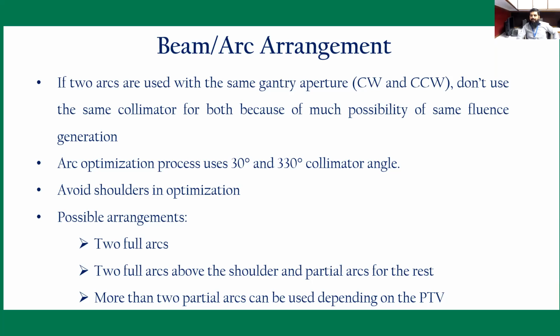If you are planning a head and neck patient with VMAT and you are using complete arcs, avoid the shoulders in the optimization. We cannot put the patient's hands up for the patient setup, and the shoulders are in between, so you have to avoid the shoulders.